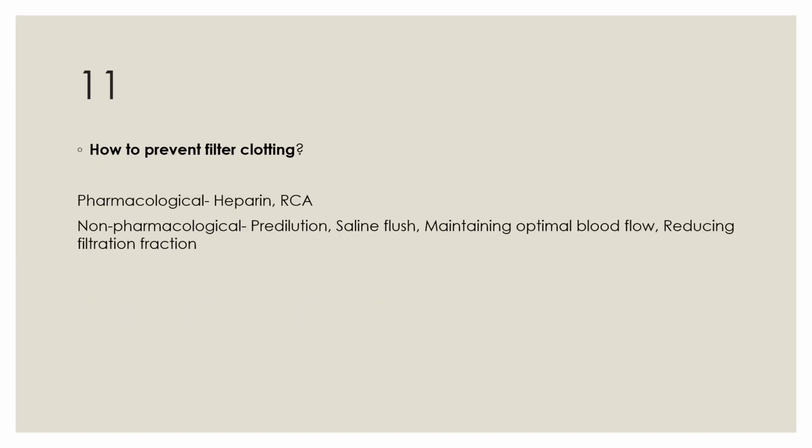How to prevent filter clotting? To prevent filter clotting in continuous renal replacement therapy, several strategies are employed, primarily focusing on anticoagulation and optimizing the extracorporeal circuit. Anticoagulation, particularly with regional citrate anticoagulation and heparin, and non-pharmacological measures like pre-dilution can help prolong filter life and reduce clotting.